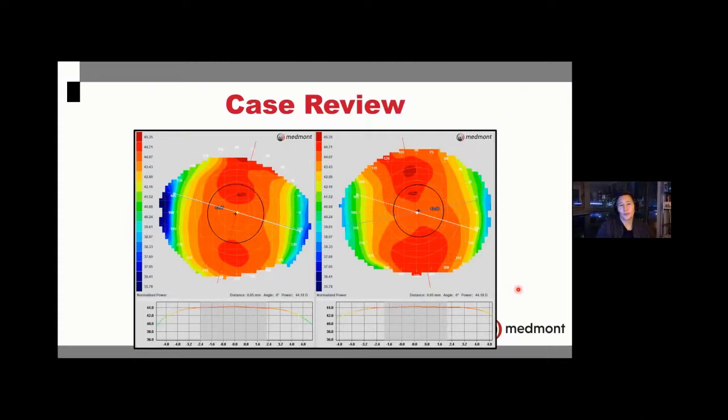Well, let's go through one more case that I thought might be fun. Here today, a corneal topographer is purchased in a high percentage of cases for myopia control practice today. So let's talk about a myopia control case. And here's one where using the composite topography, we're able to get so much of the anterior segment of the cornea. We're able to build that huge 11 millimeter ortho-K lens.